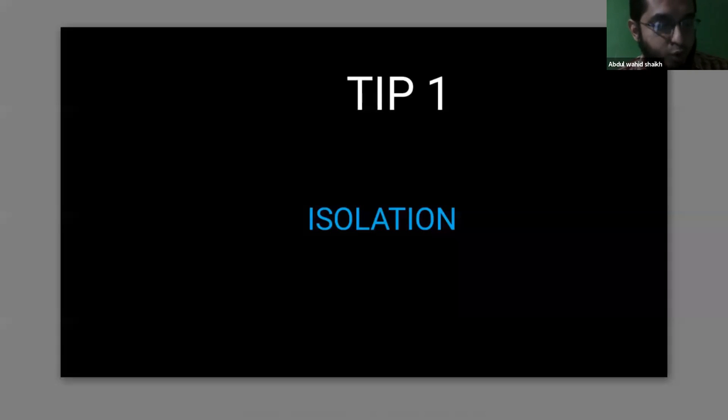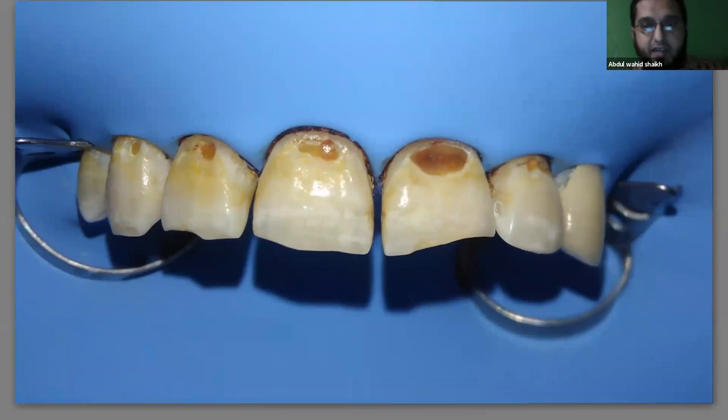Isolation is an indispensable tool. Let's say this was a patient who came to me with really bad oral hygiene and carious lesions near the gingival one third. If we're doing this restoration without isolation, one hand will be retracting the lip, the other holding suction, so your attention is diverted. When your attention is diverted, you can't do quality work — you need to focus on the minute details of the restoration.